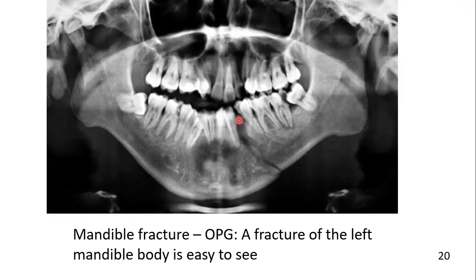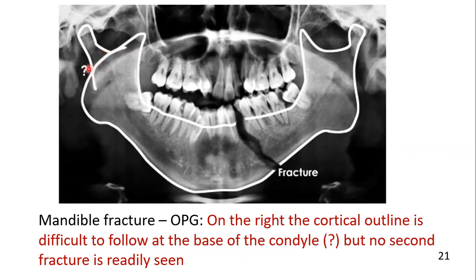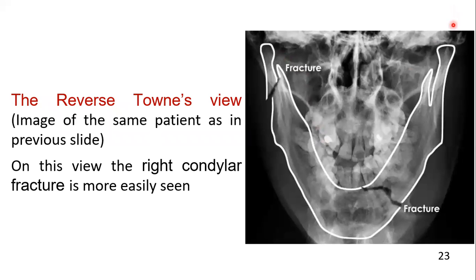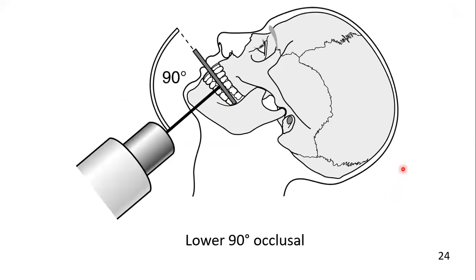In this OPG, the fracture in the body area of the mandible is clearly seen. However, there is doubt on the right side — the cortical outline is difficult to follow at the base of the condyle, so only a single fracture in the body is seen easily. Taking the reverse Towne view, the condylar area is easily appreciated and the right condylar fracture is clearly visible.